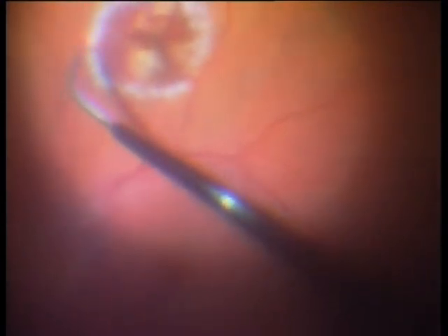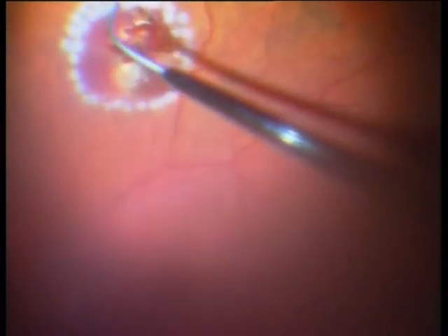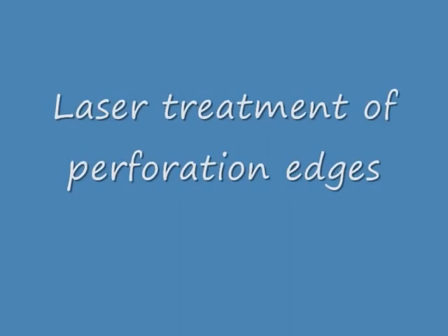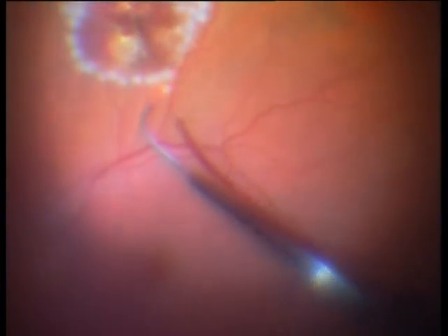I am performing no diathermy of the choroid — this is not necessary. The perforation site is quiet and calm, so only laser treatment.